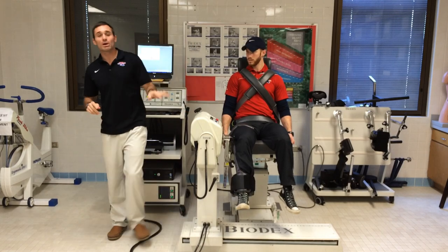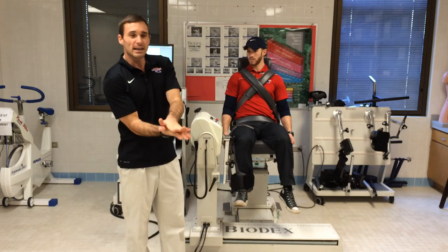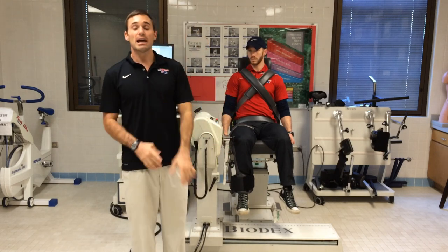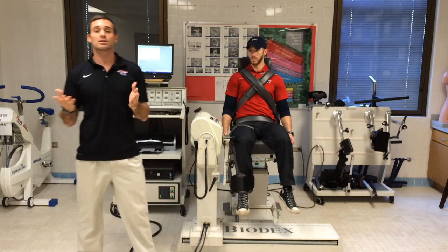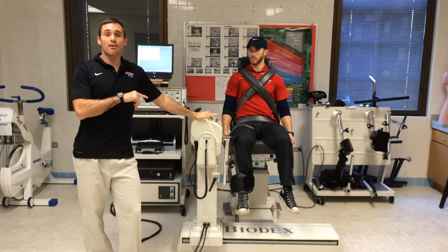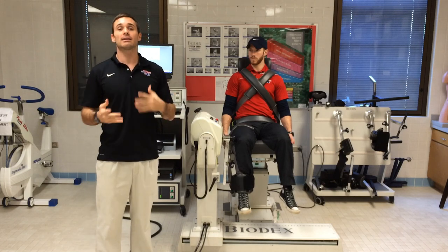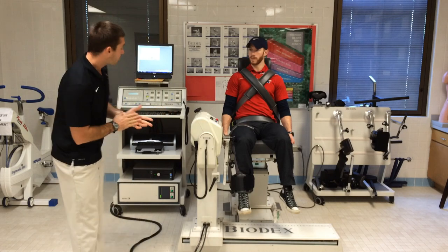The reason it's important to weigh the leg and why we have them do the deep breath is because if they're putting any kind of pressure on the pad, it'll increase the weight. If they have any kind of contraction in the leg, it'll cause it to weigh a little bit less. We want to get the actual weight of his leg because the machine itself will add that and will correct for that when we're doing the test. And it'll take that into account when we're calculating power, work, all these different variables.